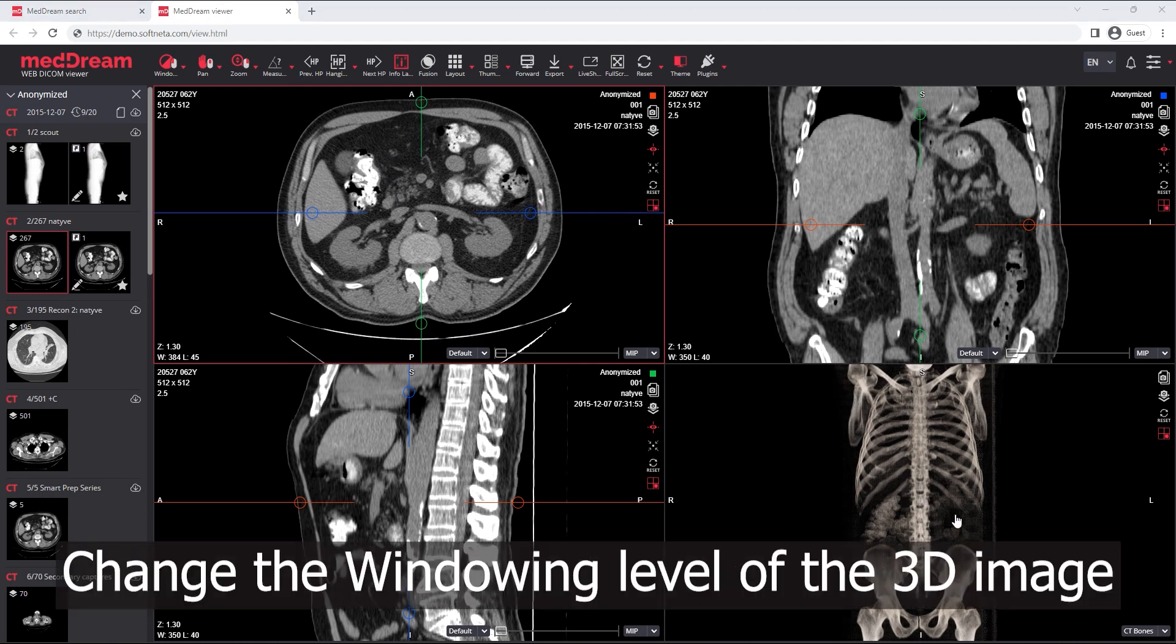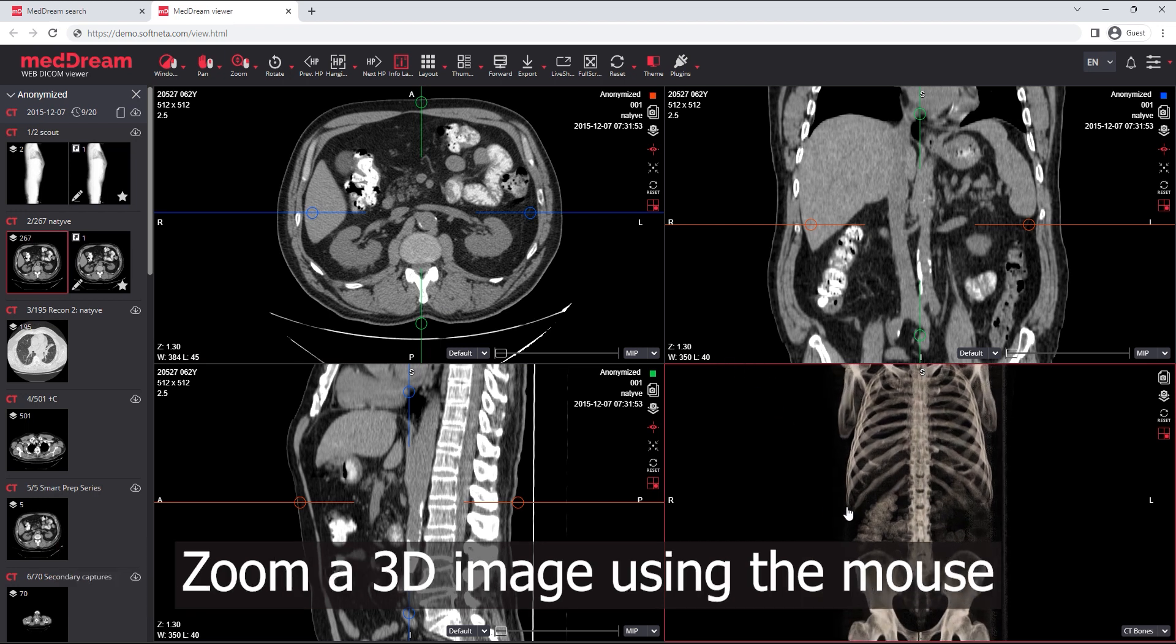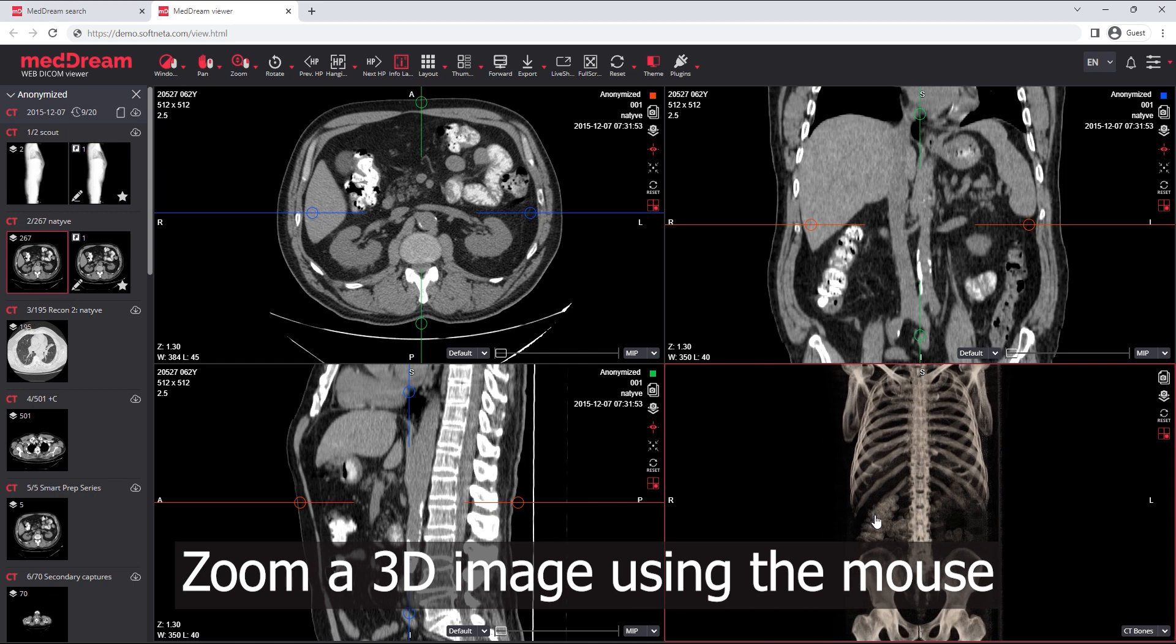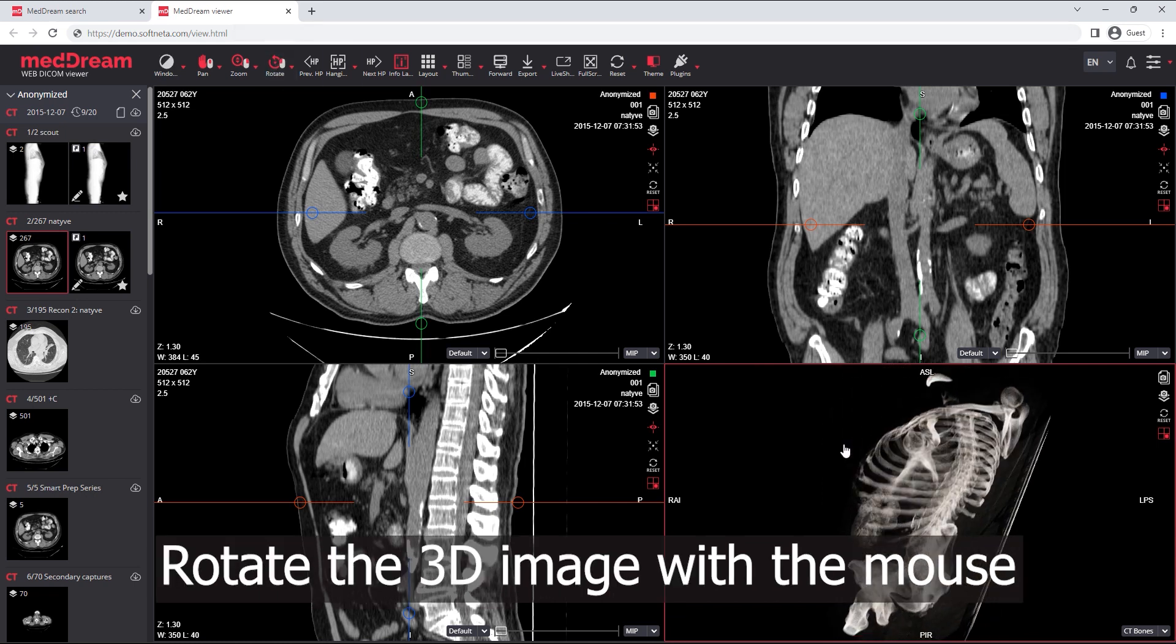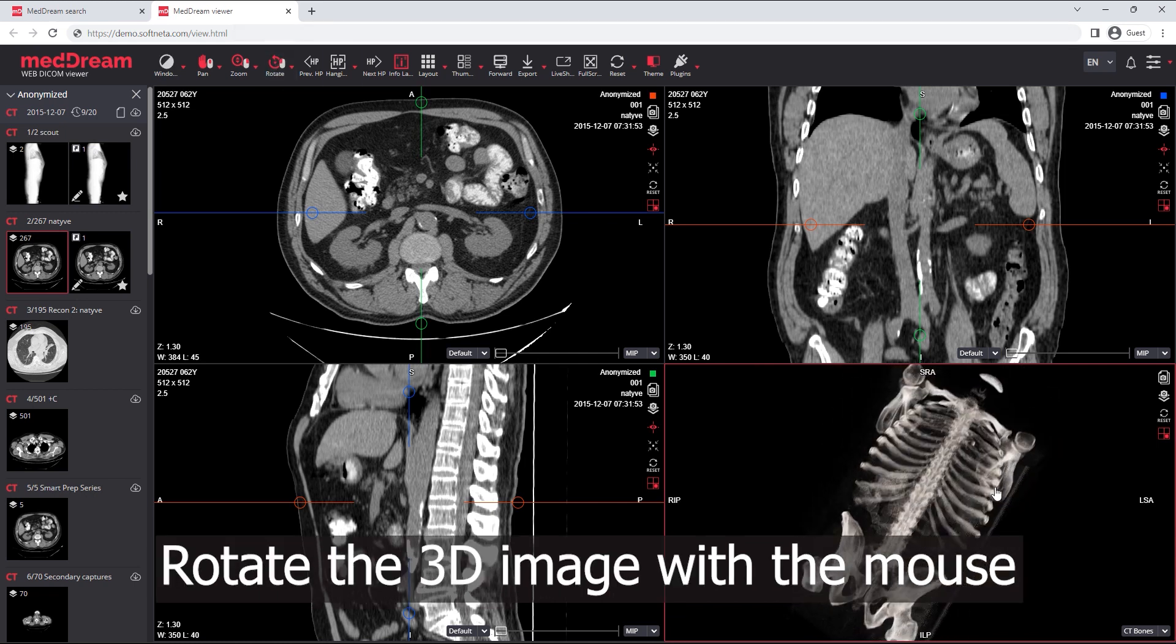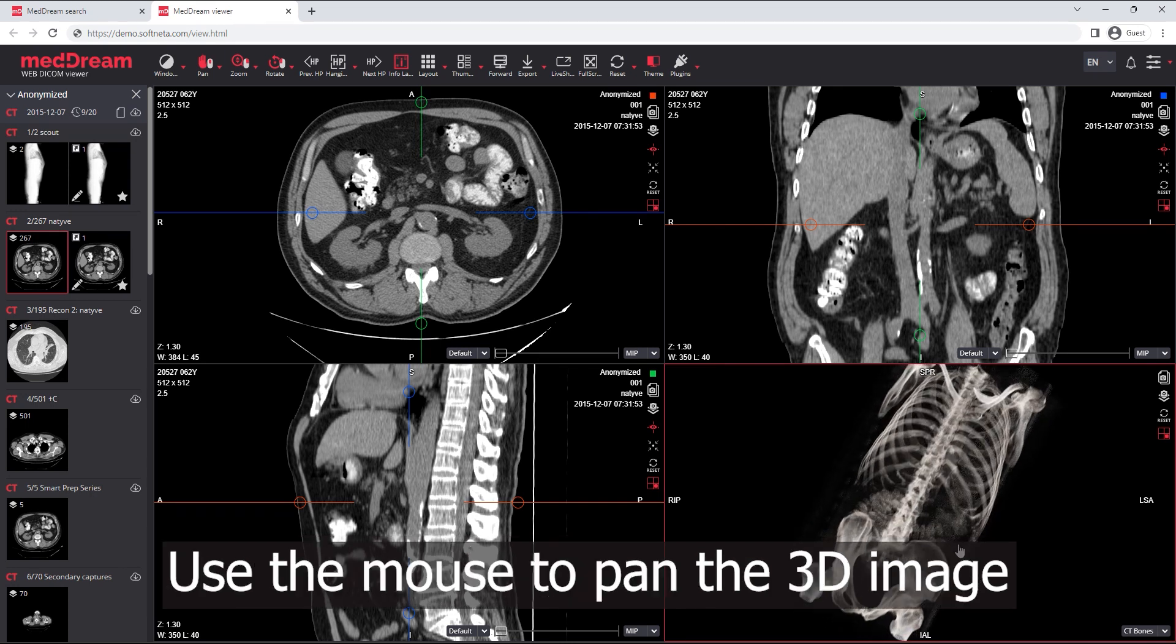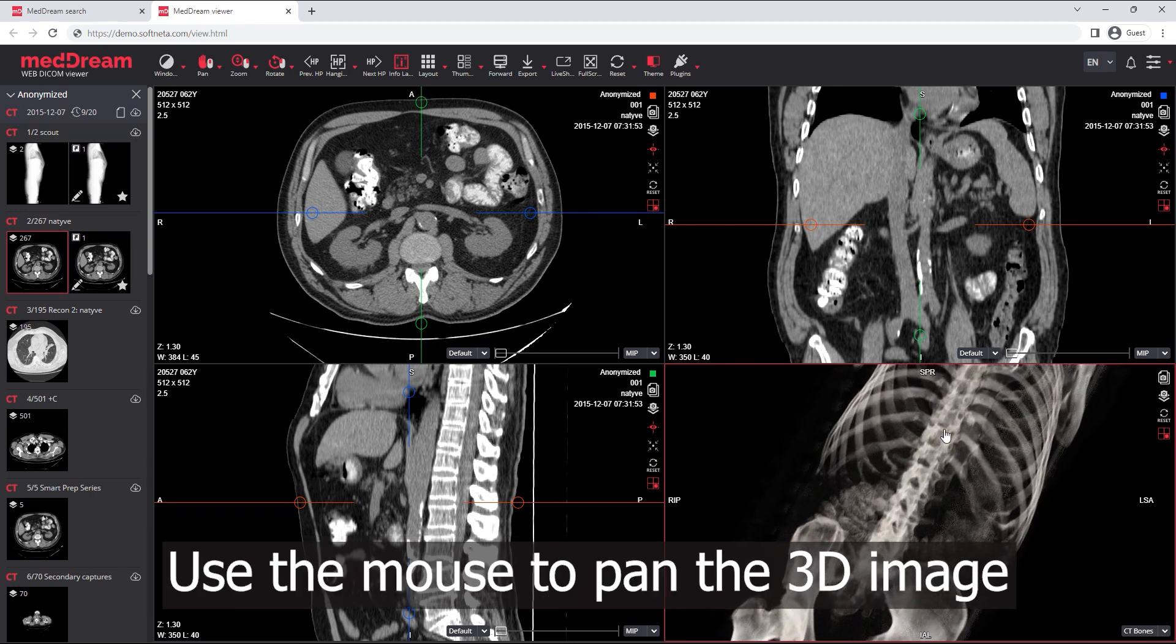Change the windowing level of the 3D image with the mouse. Zoom a 3D image using the mouse. Rotate the 3D image with the mouse. Use the mouse to pan the 3D image.